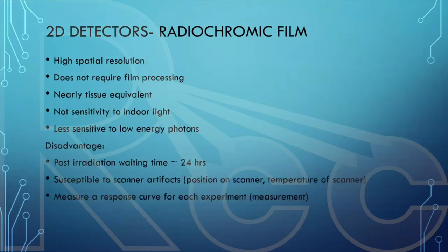Okay, we can use the film in combination with an ion chamber to do patient-specific dosimetry, though, right? Yes, we can. My recommendation, because it gets very tricky, I have some experience, for example, with Tomo, using the cheese phantom.